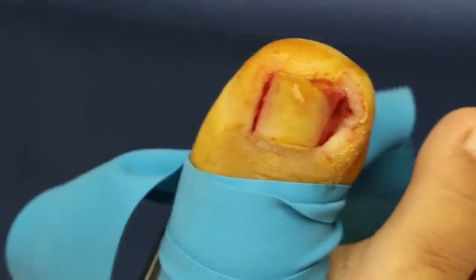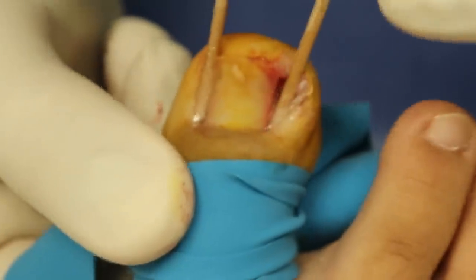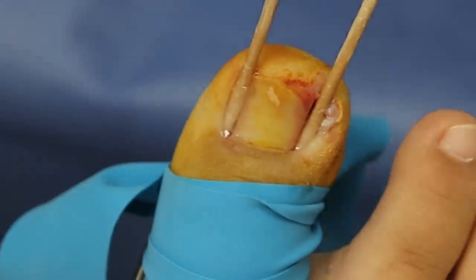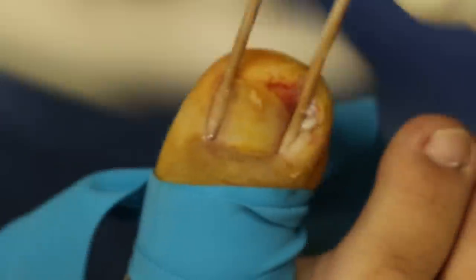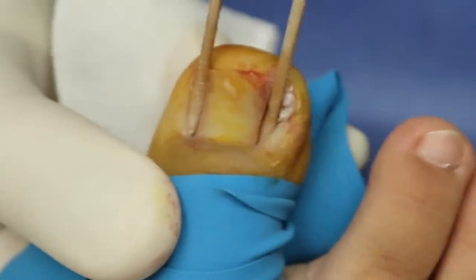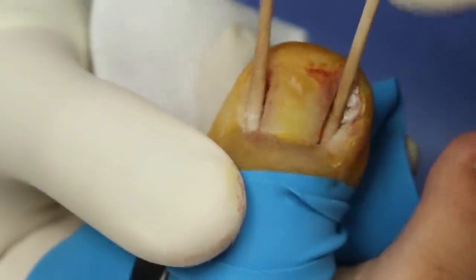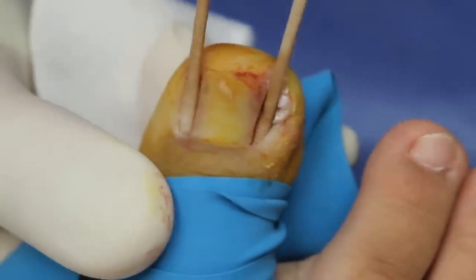You haven't felt anything so far and you shouldn't feel anything now. Basically what we removed were the parts that were going downwards. The body's going to fill the corner in with completely new healthy skin. There'll be no hole, it'll be nice and flat. Even if you cut down on the side, you will not get an ingrown because there'll be no downwards curvature.